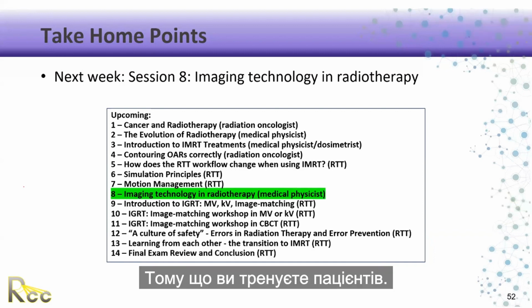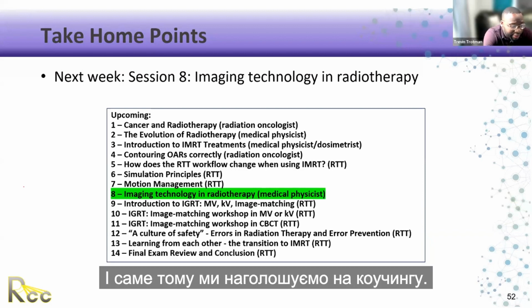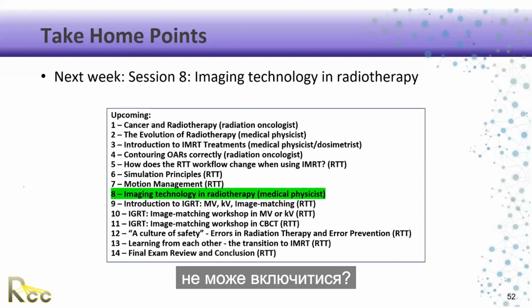Because you're coaching. So you're basically in control of that as the RTT, because you're coaching the patient. And that's why we stress coaching. Okay, but are there instances where a patient just suddenly fails in cooperating? Do you stop the treatment?